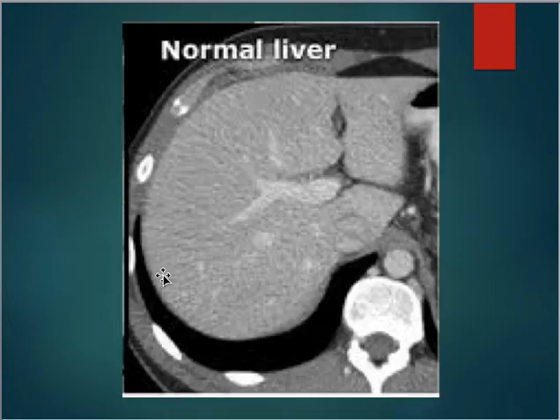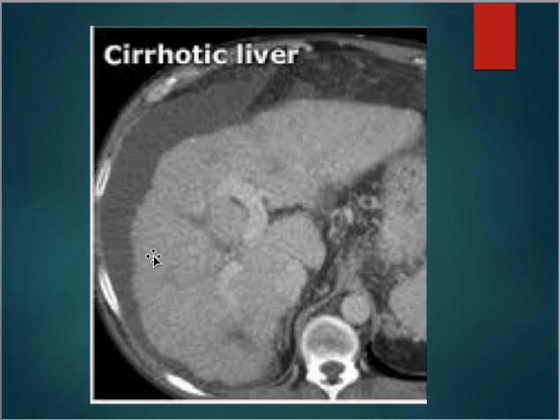This is a normal liver. Nice clear borders, a nice gray color. Everything looks fine. And then this one is cirrhosis of the liver. So you can see the normal tissue here of the liver, and then you've got all this darker tissue here. Cirrhosis is caused by scarring and inflammation. So you're kind of seeing that inflammation on the liver here in this scan.